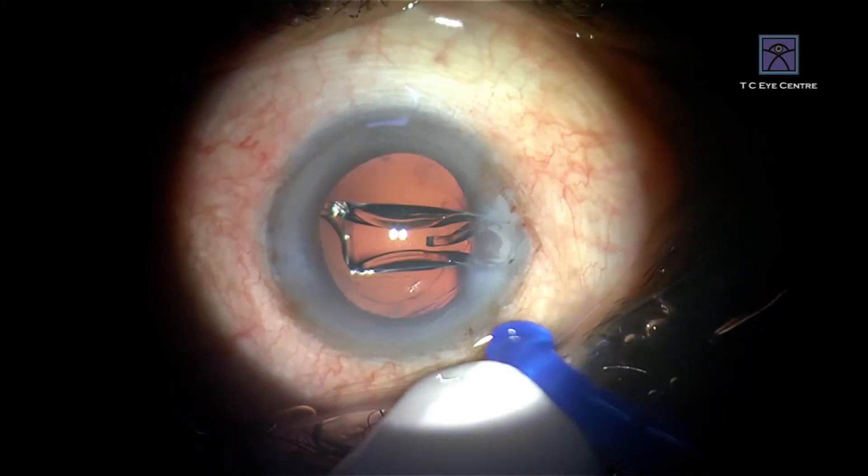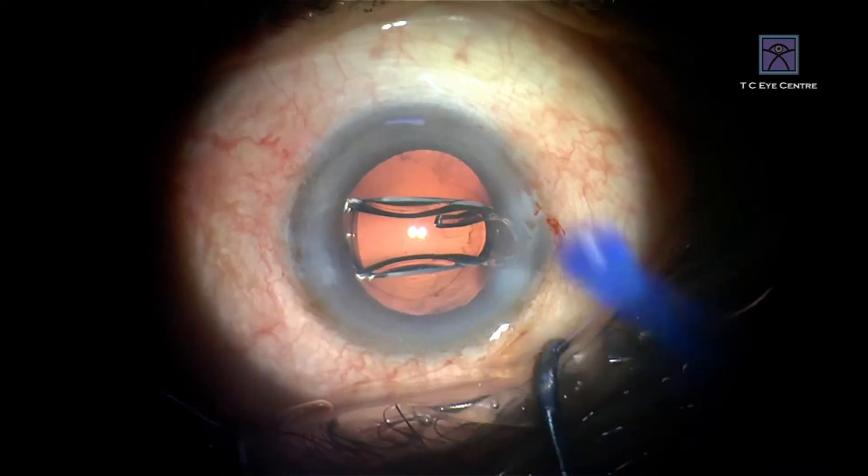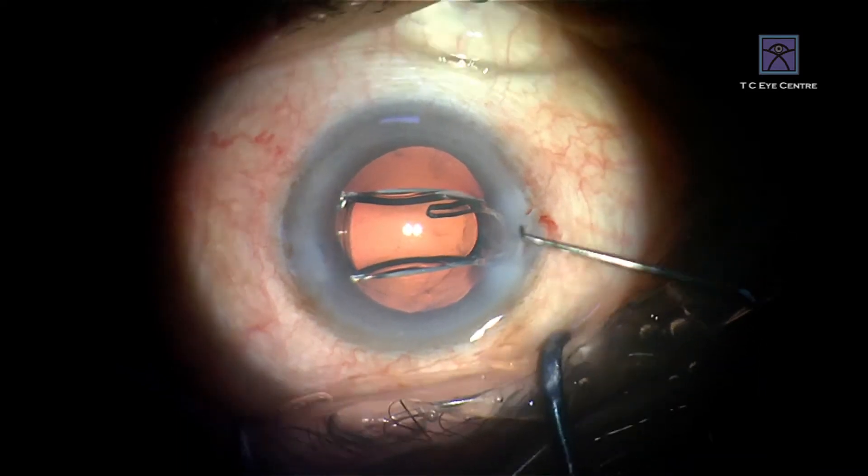Don't push the plunger beyond this — if you do, the plunger is going to expand inside the wound, it gets jammed, and you can't take it out. So that is one thing you have to be careful about.